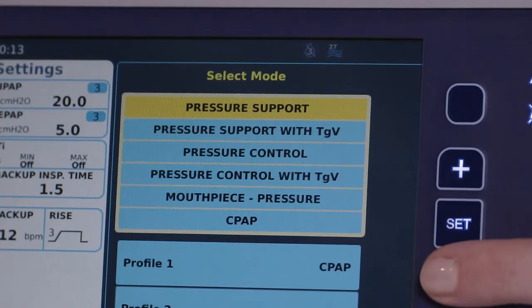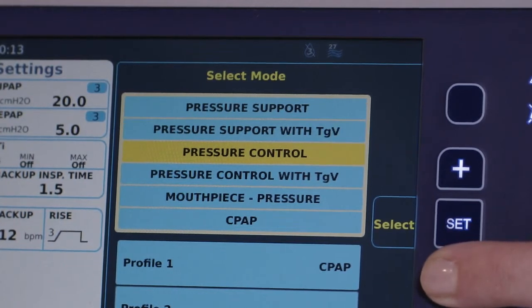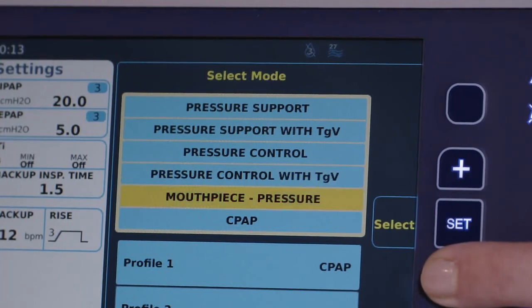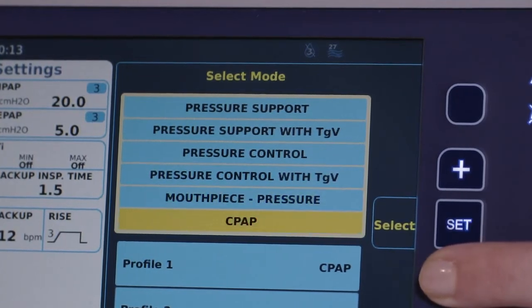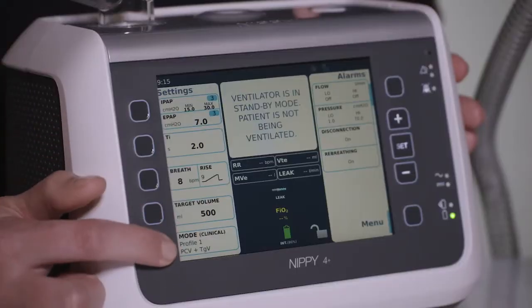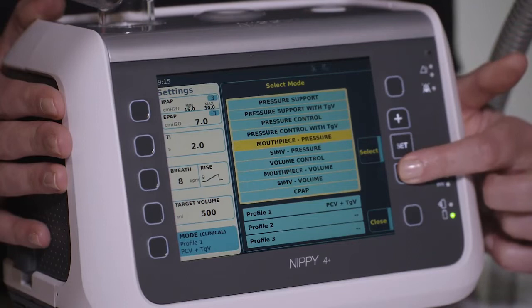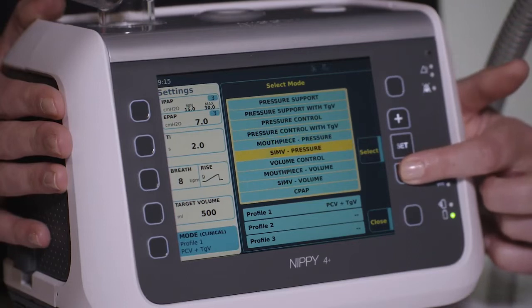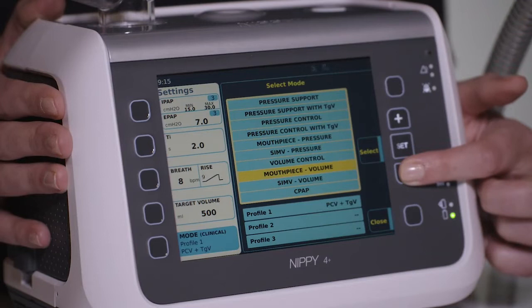When using the NIPI-4 you can select the following modes: pressure support, pressure support with target volume, pressure control, pressure control with target volume, mouthpiece pressure, and CPAP. The NIPI-4 Plus has the following additional modes: SIMV pressure, volume control, mouthpiece volume, and SIMV volume.